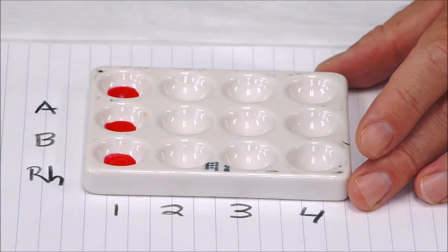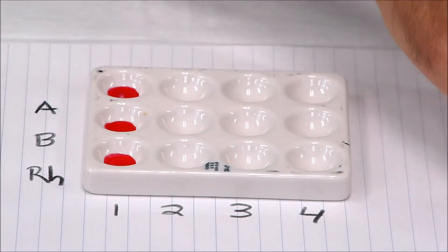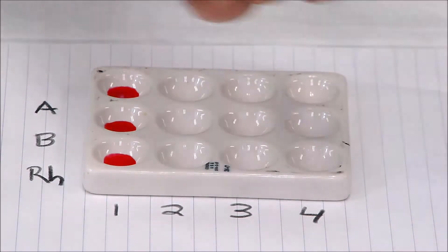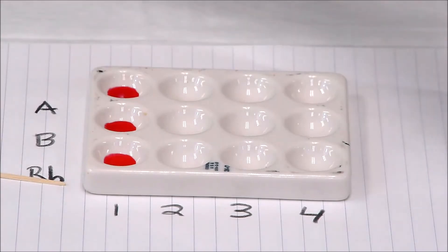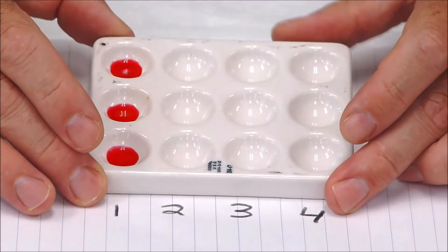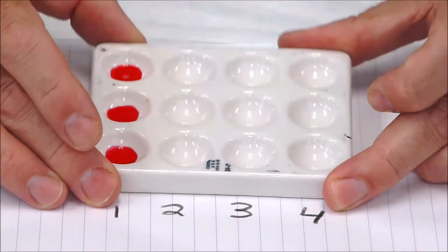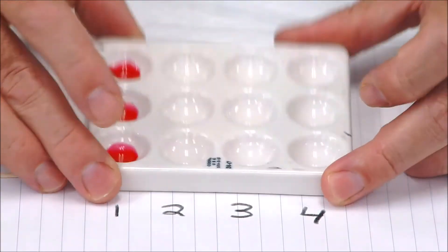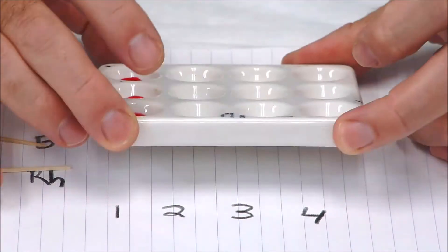Now at this point we need to mix our samples around. You can use toothpicks, so I have some here, but if I do use toothpicks I want to make sure that I use a different toothpick for every sample in every well because I don't want cross-contamination. I'm going to do it without the toothpicks—I'm just going to try to agitate a little bit, going up and down. We're looking for clumping or agglutination.